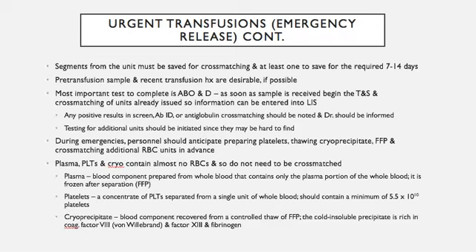So once you've got that initial emergency release done, hopefully you've gotten a patient sample by then, and you're doing all of your ABO, RH, antibody screen testing, then you can start selecting compatible units. Platelets, plasma, and cryoprecipitate contain almost no red cells, so they don't have to be cross-matched.